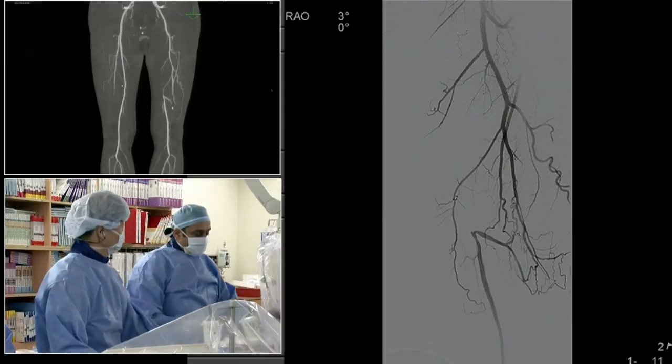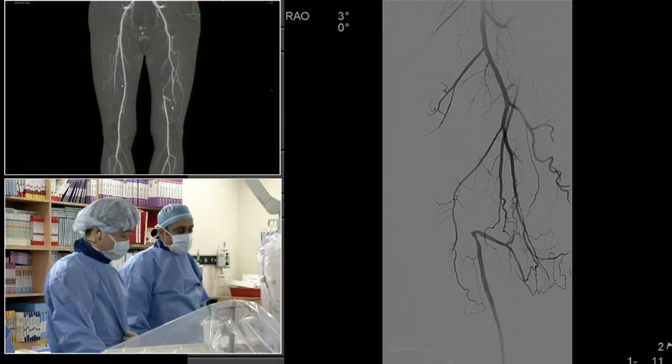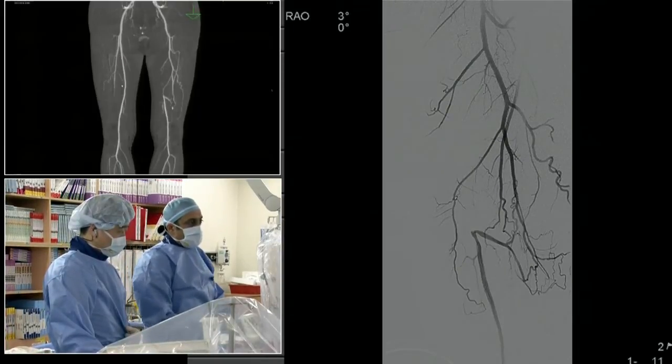Yeah, even though the trials didn't show an acute occlusion rate resulting in acute limb ischemia in the trials, that's always a concern, especially with this anatomy here where there's one large collateral that seems to be reconstituting. So I'd be a little concerned about Viabahn here.